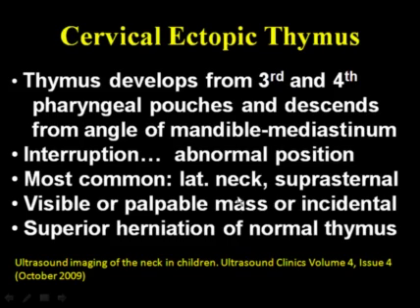Cervical ectopic thymus is typically seen in the younger patient population. A lot of our younger patients in their 20s and 30s who can really hyperextend their neck, we will see cervical ectopic thymus or even normal thymus that extends up into the neck because they have a great ability to hyperextend.